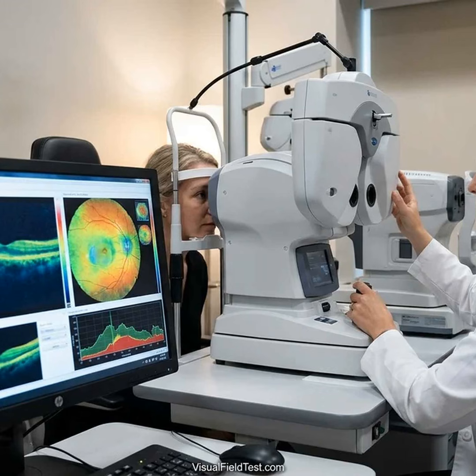In advanced glaucoma, the RNFL signal hits a floor, and doctors must rely on other measures like macular scans or vision tests. Throughout all stages, OCT scans should always be correlated with your visual field tests, eye pressure readings, and nerve exams. In plain terms, OCT tells us about nerve thickness changes. It can show damage before you notice it, but it can also be fooled by things like cataracts or abnormal eye shape. As one expert review notes, decisions in glaucoma require combining both structure, OCT, and function, fields, along with other factors for every patient.